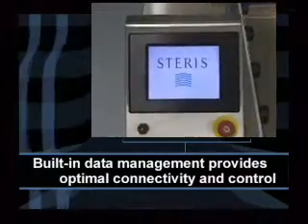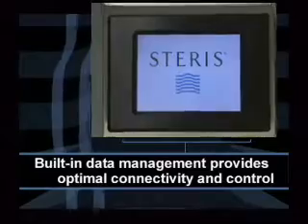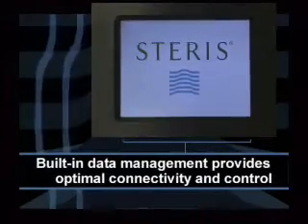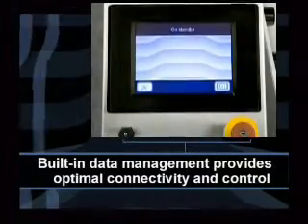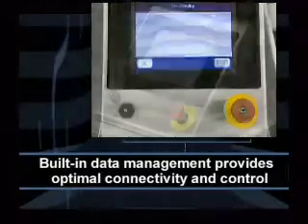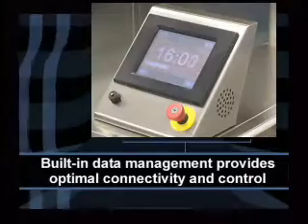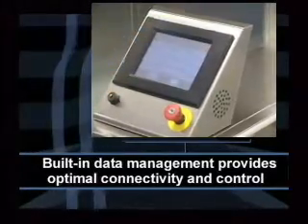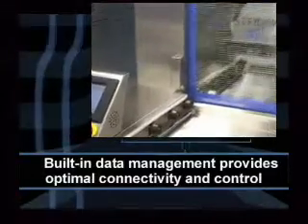Built-in data management provides optimal connectivity and control, which helps ensure compliance to standards and provides a high level of confidence in the washing process. The Vision Next Generation PC Control enables users to monitor and visually observe cycle and process status in all of the chambers simultaneously, including chemistry volume and other time-based variables. Additionally, all systems can link to any hospital-wide instrument tracking system to improve traceability of loads.